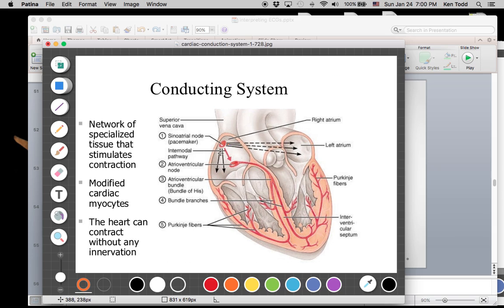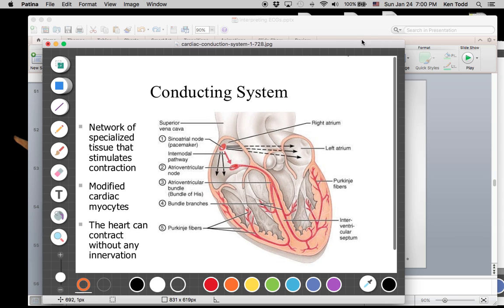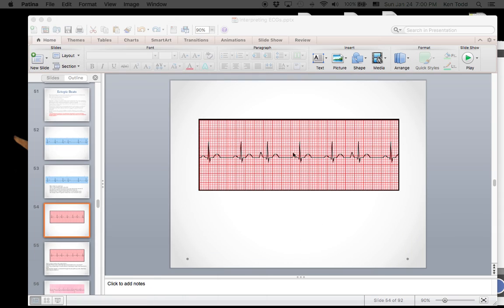But after it's triggered in the atria, it goes through the AV node and the rest of the conduction is normal. But I can tell that it's coming earlier than expected because everything else in that heartbeat looks the same as the normally conducted beats, and it's only my P wave that's different. I can tell that that complex is of atrial origin. So I would call this a sinus rhythm with a premature atrial contraction, and actually with two of them. And because they look identical, I would say that they are unifocal.